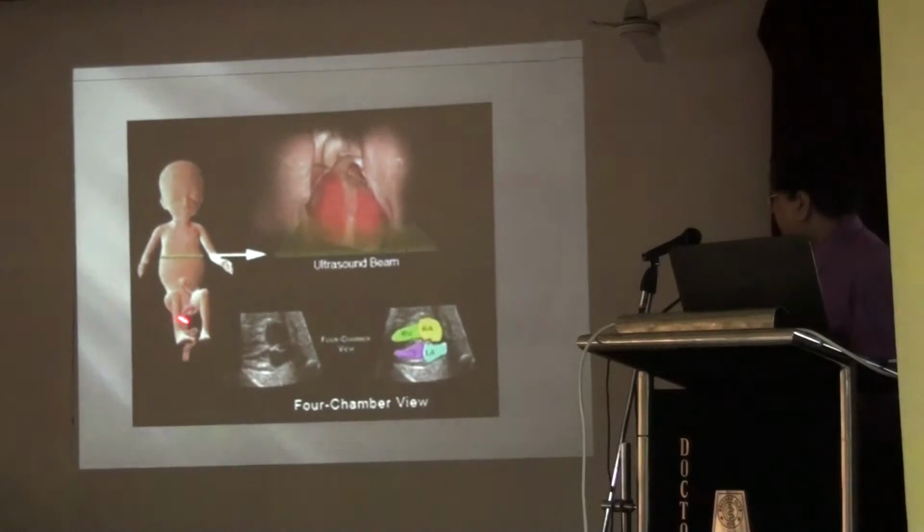And the last part is fetal echo, which has been applied in the last 2-3 years. Fetal echo is also an important part when we have to see the cardiac anatomical structure at the developing phase. We have to see particularly the RA, LA, LV. It is important for TGA, fetal edema, fetal heart blocks, and many other important findings, and particularly 3D echo, where we can get important information for fetal echo.